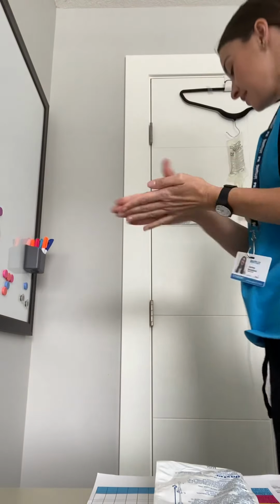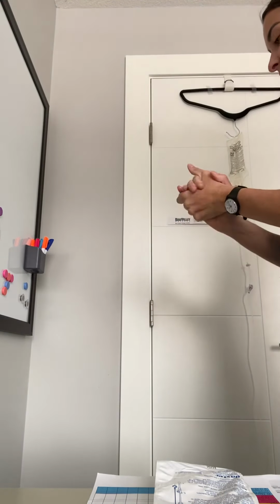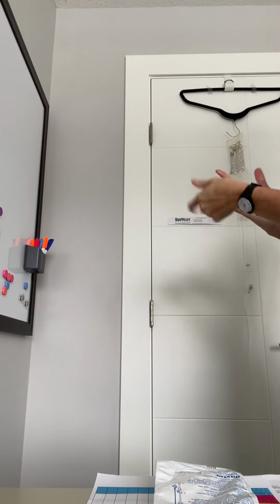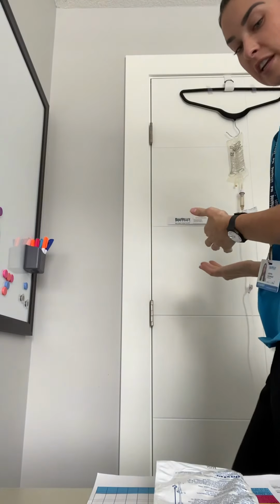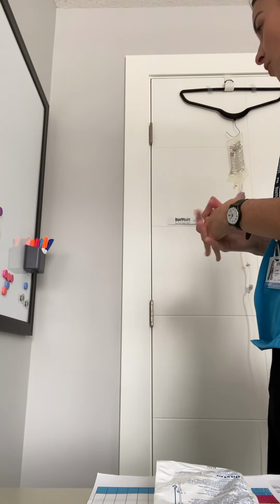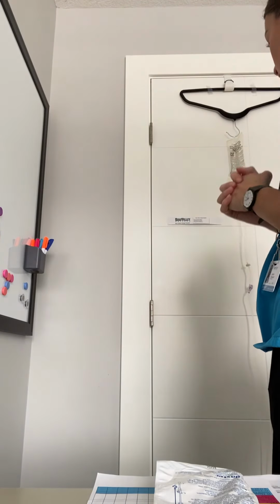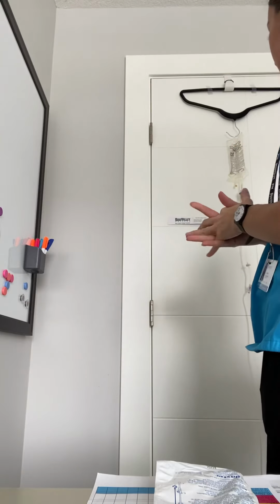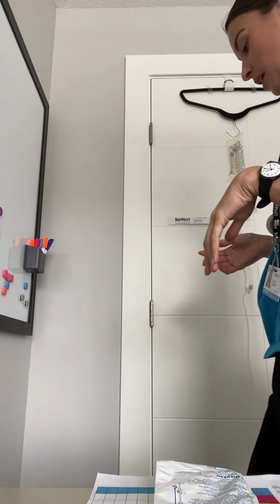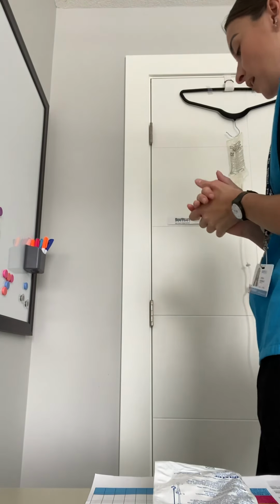Hi, good afternoon, Allison. My name is Jamie McClelland. I'll be your student nurse today, and I guess I could say nurse as well. What I'm going to be doing is administering your dexamethasone, which is for your nausea and vomiting from your chemo. I know you had it this morning at 0900, and we're just going to give it 6 hours later, which is now at 1500. Before I get started, I just want to put on the brakes of the bed and provide privacy for us as well.